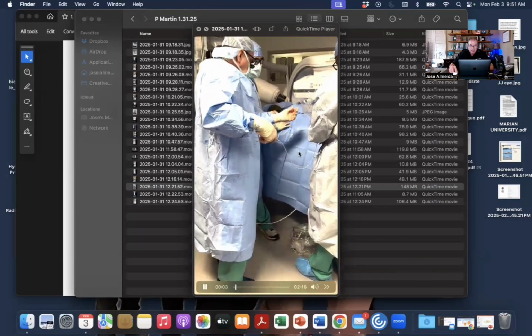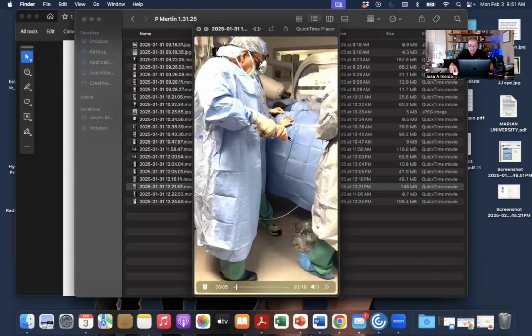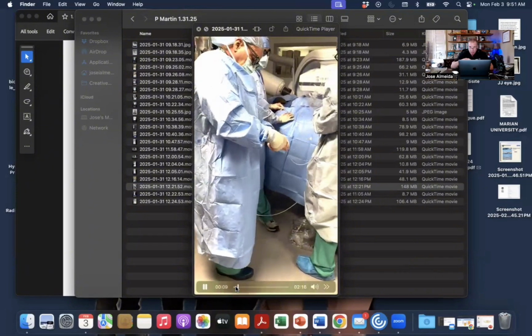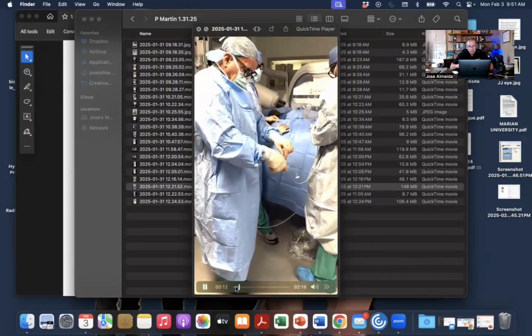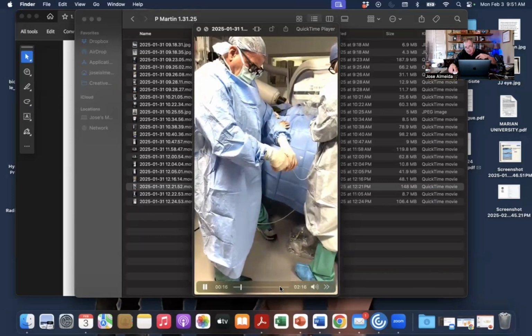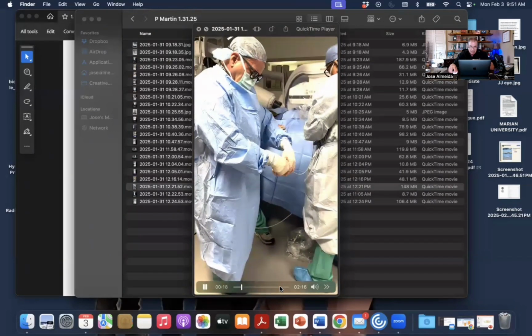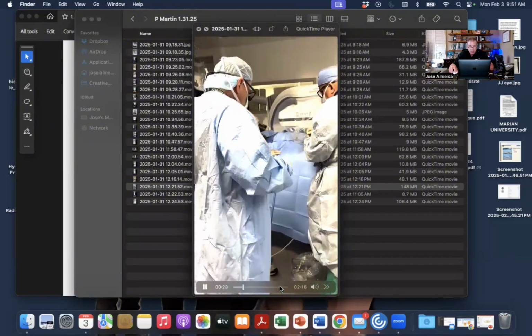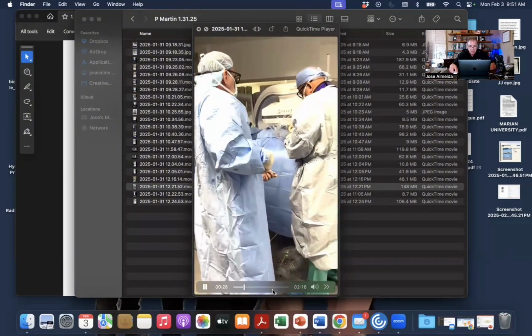Here we are prepping the Rev Core, and we're going to come down from above. The plan was to come down from above, go through the stent, thrombectomize it with the Rev Core, and hopefully be able to get into the distal stent at the level of the groin and actually get the device into the native occluded common femoral vein.